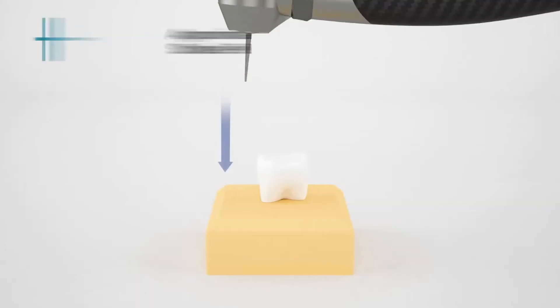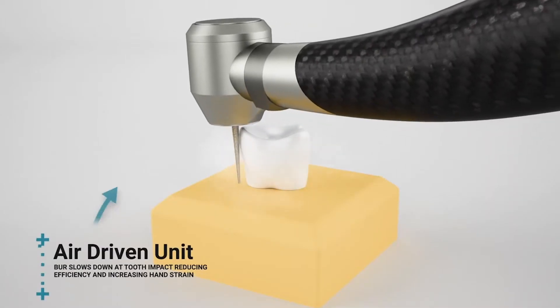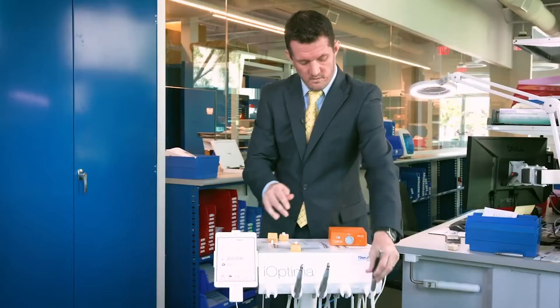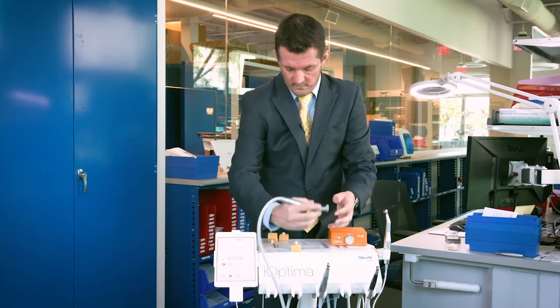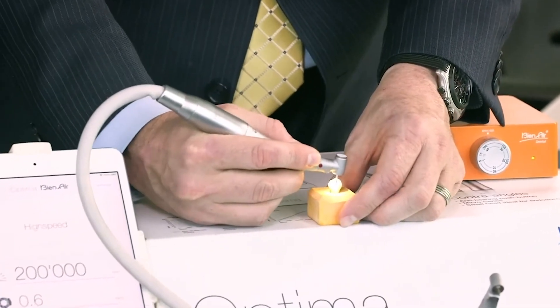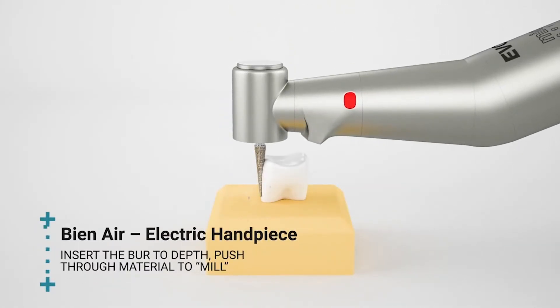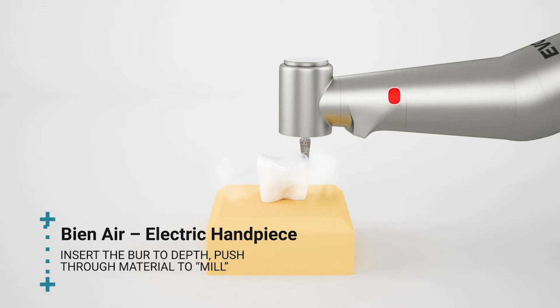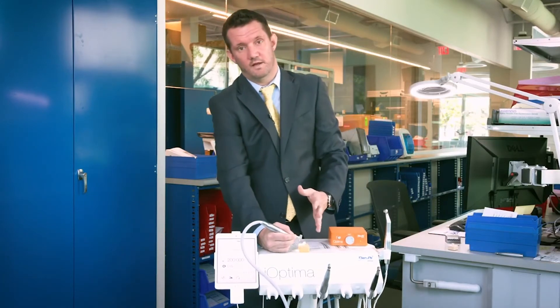You need to have it very close to maneuver it because you're making repetitive strokes back and forth. So with an air driven you paint brush, with an electric you mill. What you do is you balance the hand piece in your hand. And instead of moving the burr over the tooth repetitively, what you're going to do is just insert the burr to depth. Once you've got your depth cut then you just move it around in the margin. And so this is more of a milling than a paint brushing.